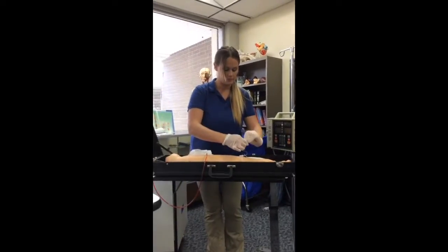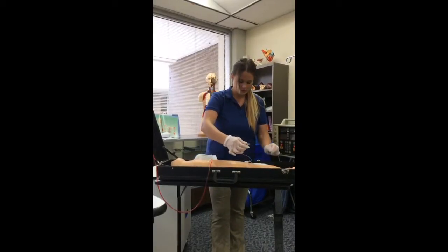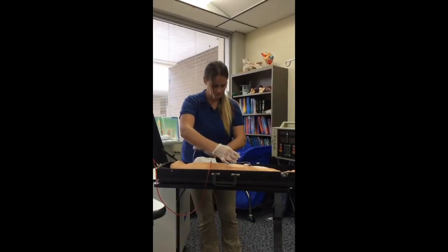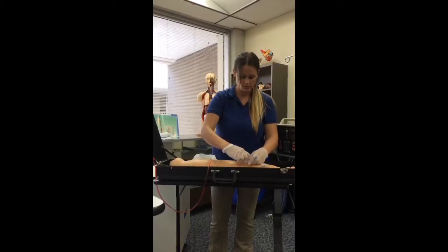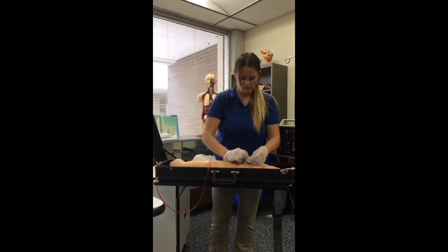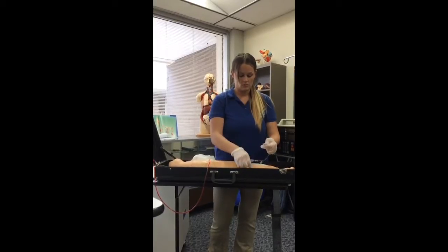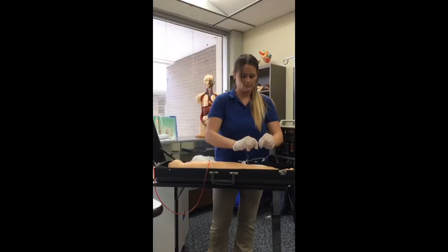Go over here to my medication line and connect it. First I'm going to clamp this, make sure that's clamped. No, leave it unclamped. I'm going to connect that.